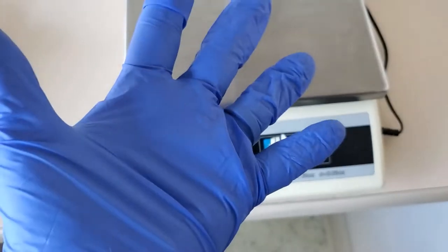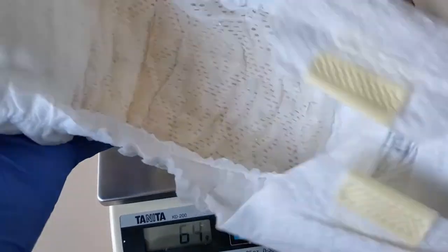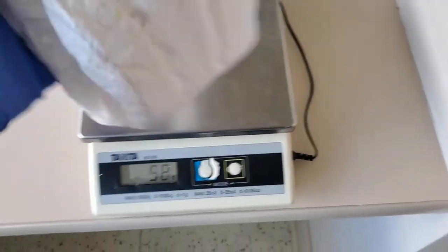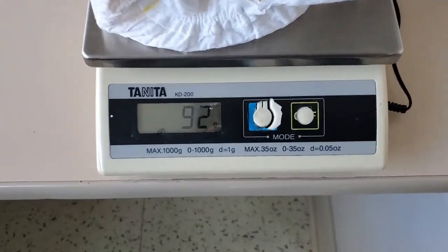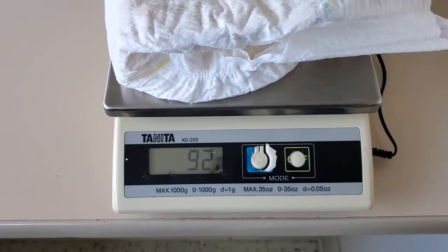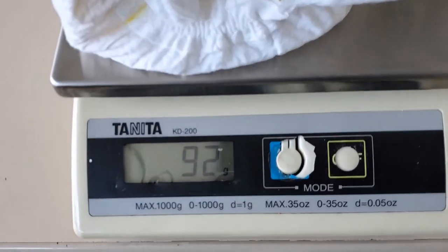Make sure you have gloves on. Then take this diaper and open it up. Make sure there's no baby wipes inside — this is just pretend apple juice. If there are baby wipes in there, take them out and throw them away. You don't want them in your diaper weight. Put the soiled diaper down. We've already subtracted our dry diaper weight, so this is 92 grams of urine output. On your intake and output form and in the EHR, under urine weight diaper, you would put 92.